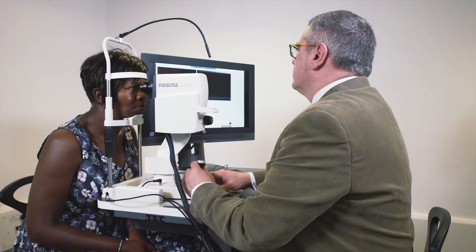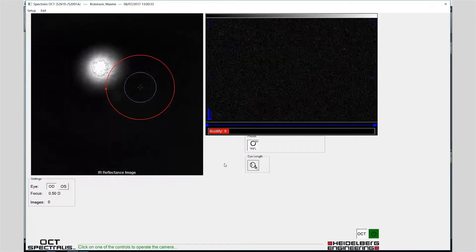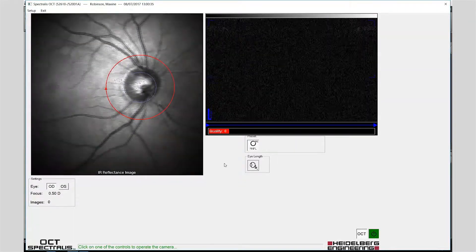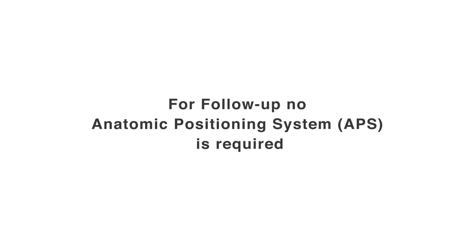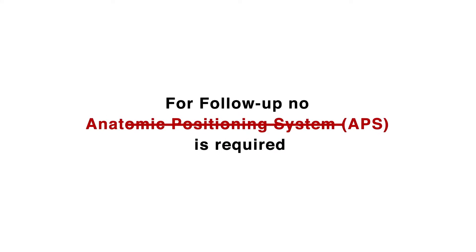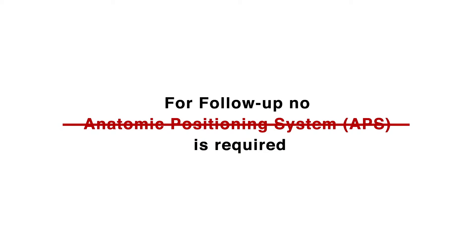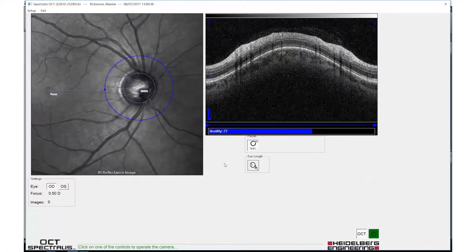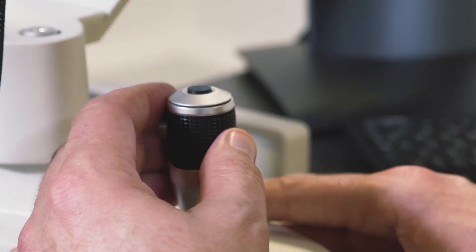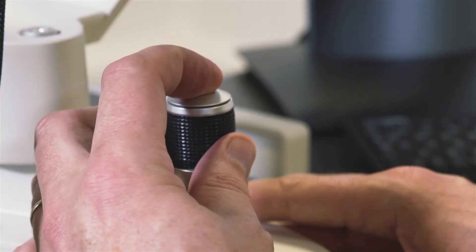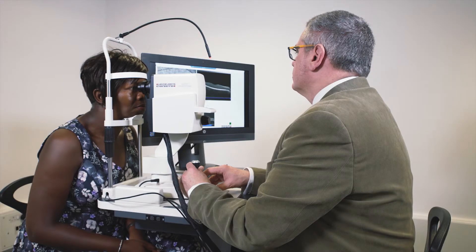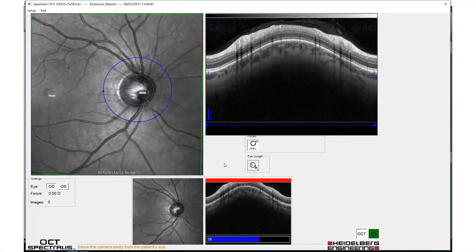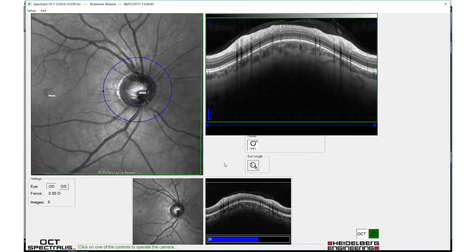Align the fundus image once more. The initial anatomic positioning scans of fovea and BMO will this time not be required, as this information is already stored in the patient record. When the circle scan has changed from red to blue and is correctly positioned, acquire the image with a single press of the joystick button. Move the camera head to the fellow eye and immediately repeat the procedure.